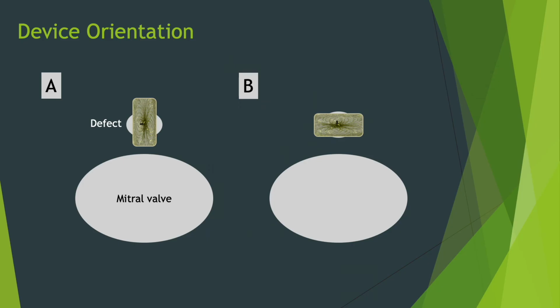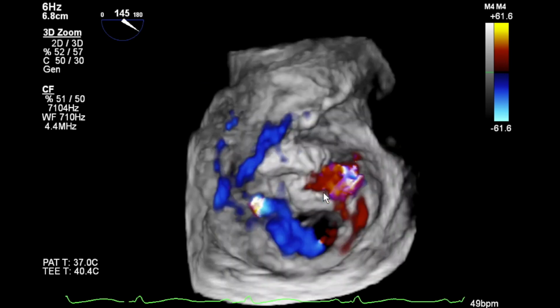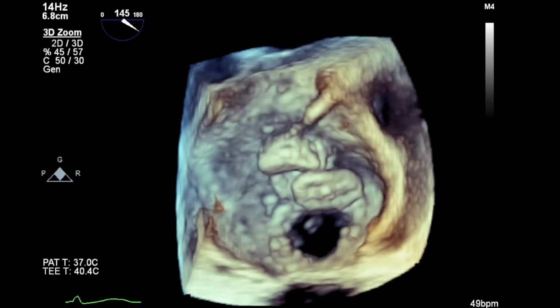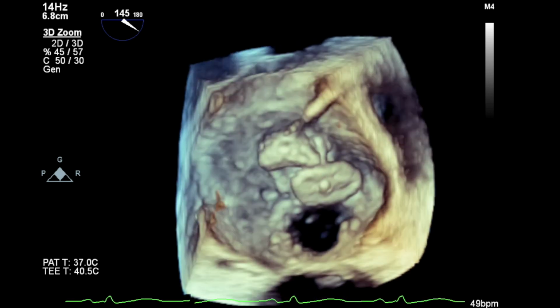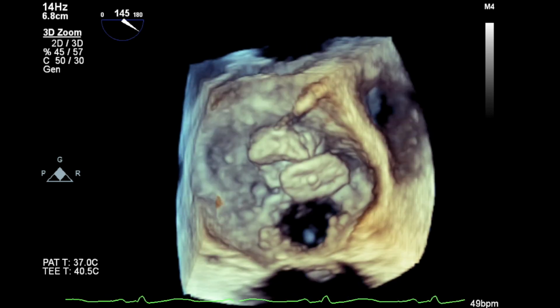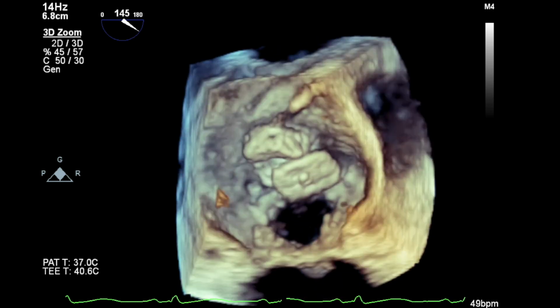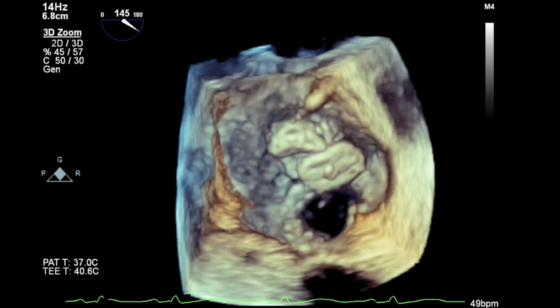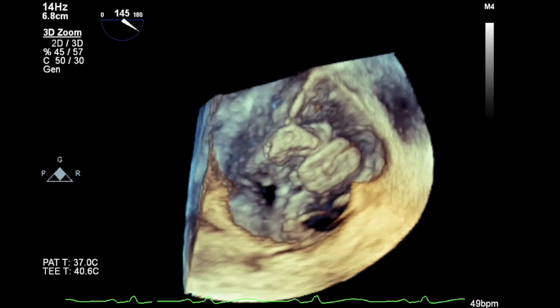So the question is whether, if I rotate the device long ways, that would actually be helpful for that leak there. So I wonder whether going to just push on a bit and rotate. So keep it, and let's just see if it will turn. I'm rotating the catheter because I can't rotate this device. So it's turning slowly. You can see it turning. I'm putting the torque on. It might be getting caught because it's quite near the other device, isn't it? It's resting on it. That's fine. I think it'll bed itself in a minute. It's turning. So I like that.